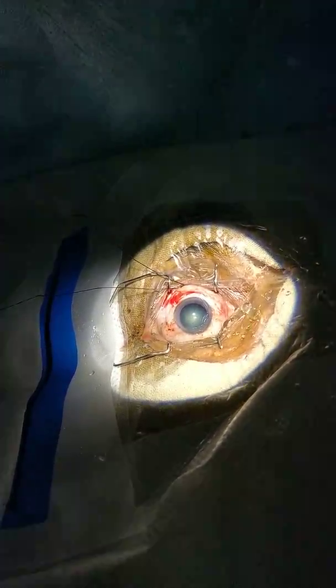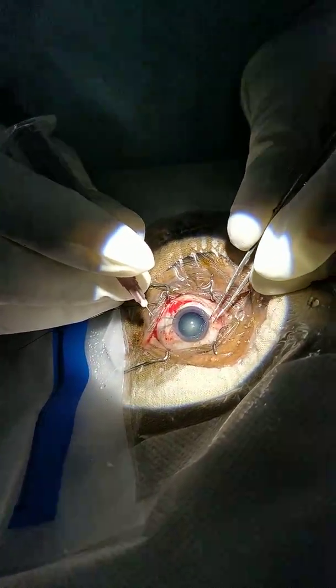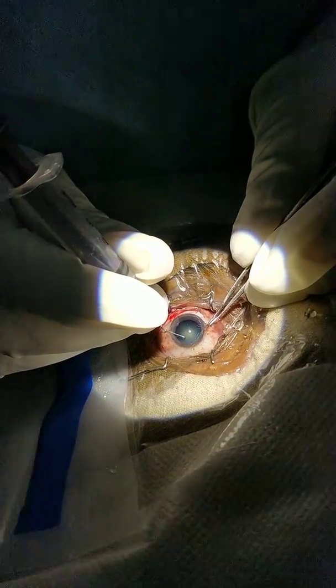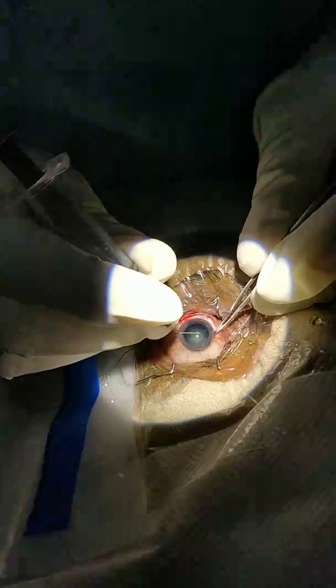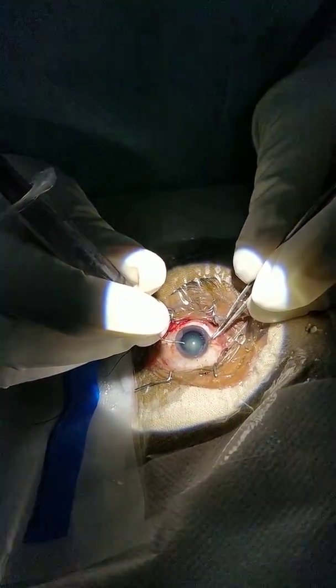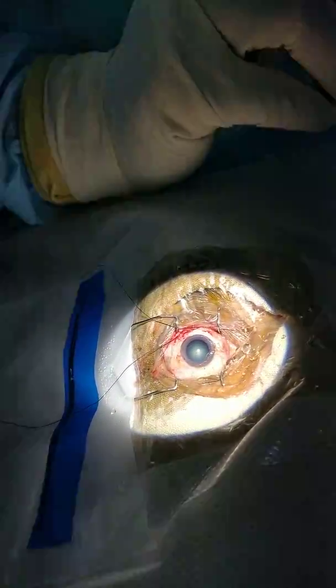Now with the cystitome I will do capsular rhexis. I am just removing the anterior capsule — this is called CCC, that means continuous curvilinear capsulorrhexis.